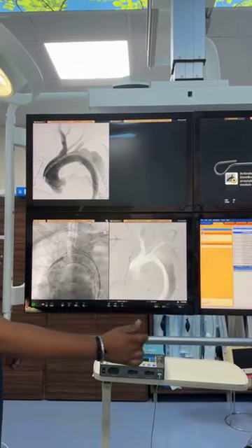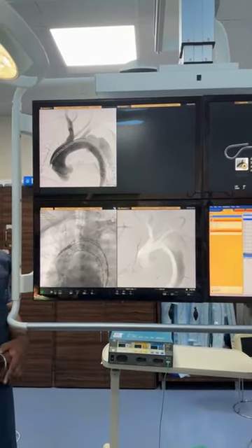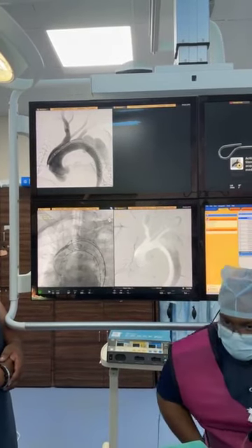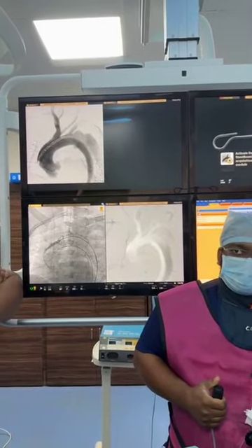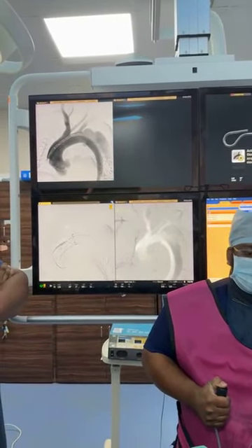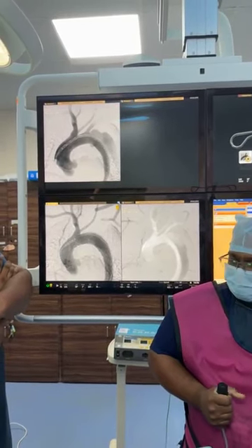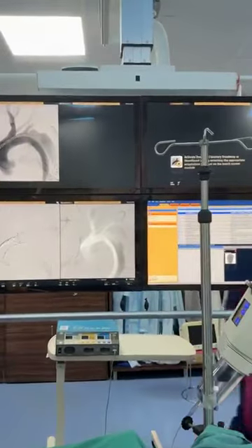Leave it. Sunil, calm down. You have a flight to catch? No, no. That's relax. Dr. Prashant, apnea, please. Dr. Prashant, inject. Perfect. Okay, fantastic. Ventilate. Ventilate.